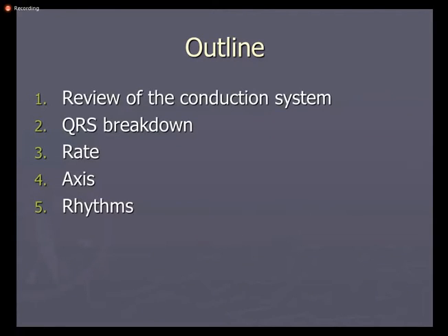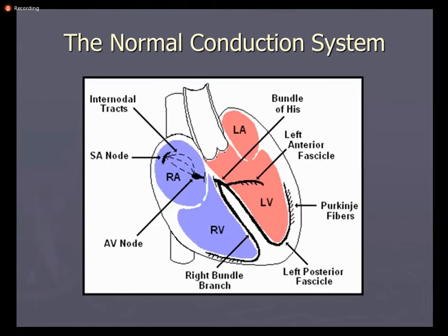ECG is basically a graphical representation of the electrical activity which is going on in the heart, and this electrical activity normally starts from the SA node.